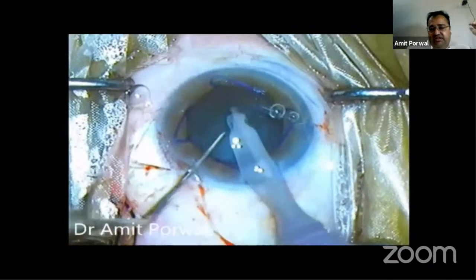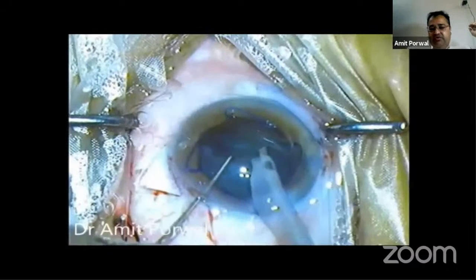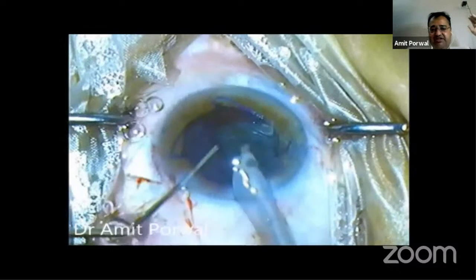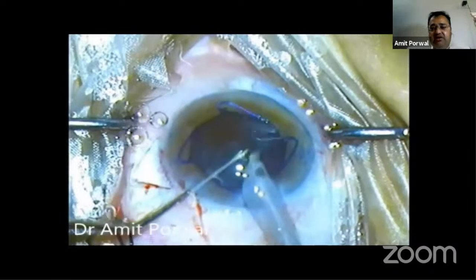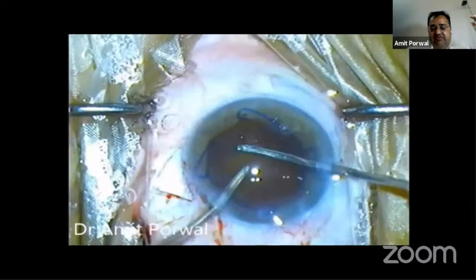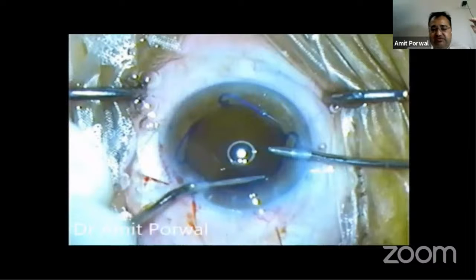And this is the dictum I follow: whenever I'm doing phaco in such a case, I always do a slow motion phacoemulsification, because I don't want much fluid turbulence in the anterior chamber. I don't want any pigment dispersion, because these pigments can clog up the trabecular meshwork also, and there is a lot of pigment dispersion which we don't want. So you lower the phaco settings and do a slow motion phacoemulsification.